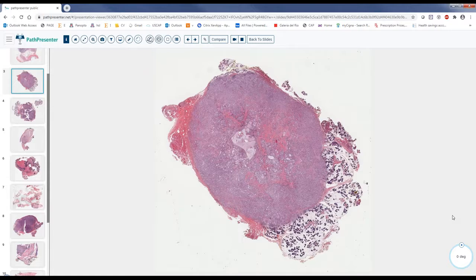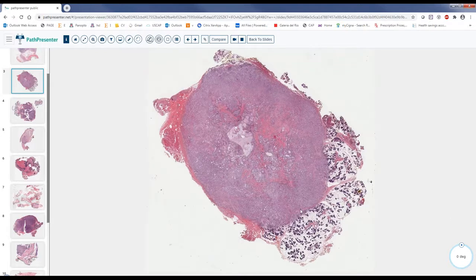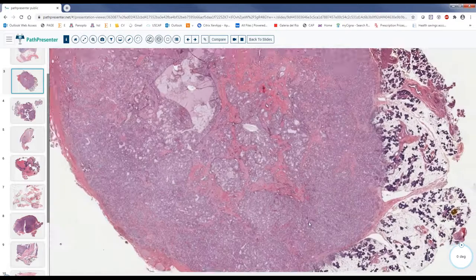The difference is the surgery: it is just simple resection for benign or low-grade, or radical resection with neck dissection, and they will be sacrificing the facial nerve. So don't kill yourself that much between benign and low-grade malignant, but really kill yourself between benign, low-grade versus high-grade. Because that really matters for them, and they really want to be sure that they're not dealing with high-grade. So, all right, it is a well circumscribed tumor.